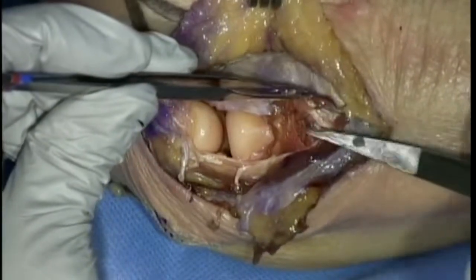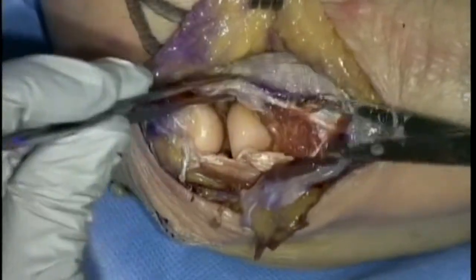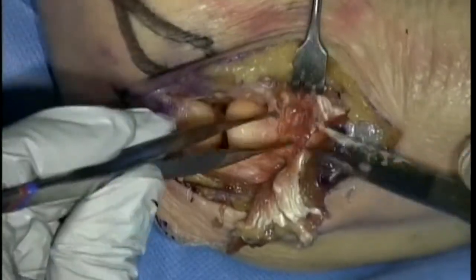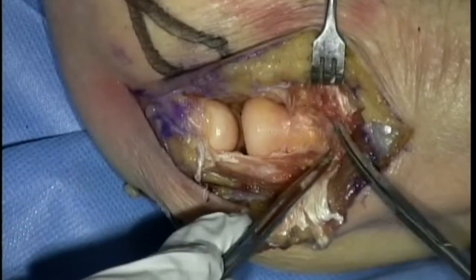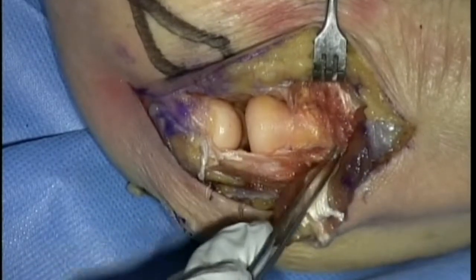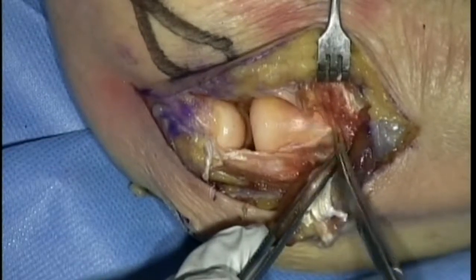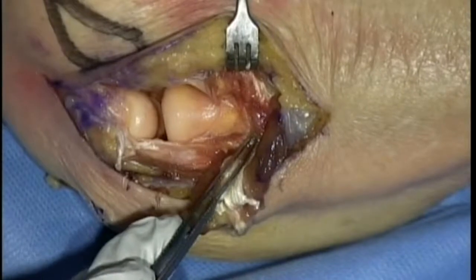And I would just basically kind of just do this, just tease it apart, and then work in the zone that I've cleared. You might start to see one little branch just coming up into view there, just as we get down there. Well, there might be a little branch just coming up right in there. It starts to arborize at that point. So here you can see you can get pretty safely down to bone and just elevate off the PIN branches like that and get your way down.